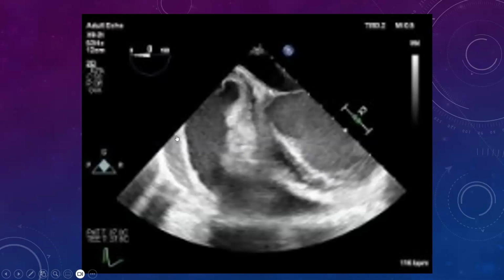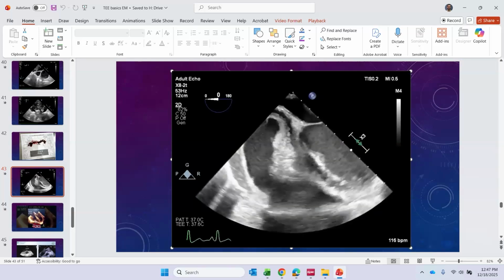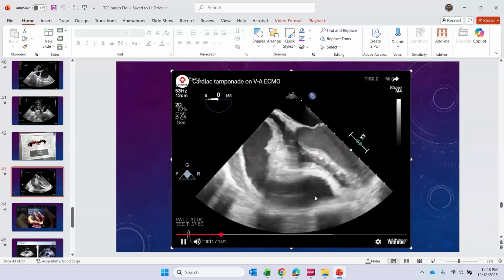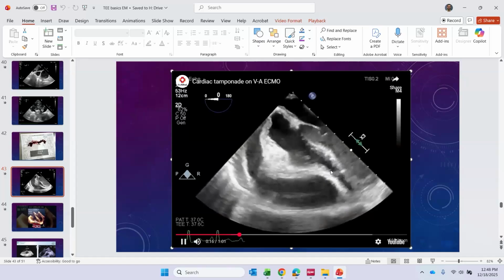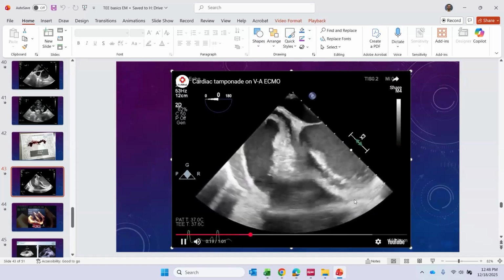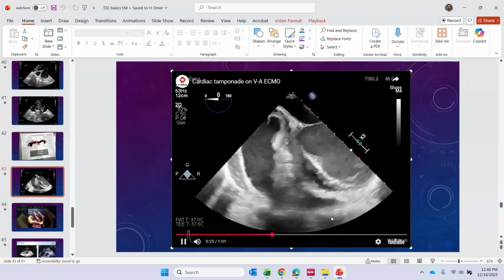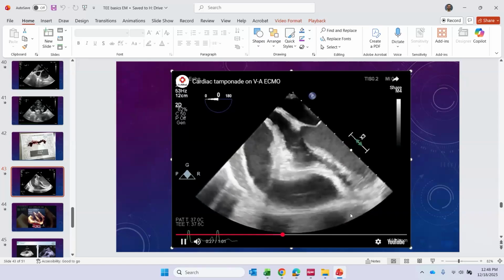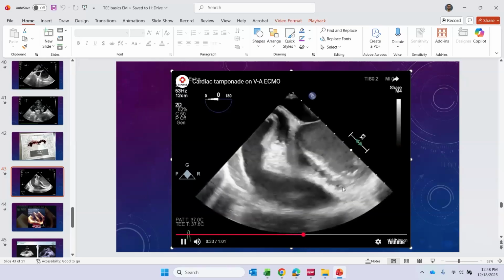Now we have a couple different pathologies. Obviously, we all know tamponade is a clinical diagnosis, as we're told over and over again, but someone want to just give a stab at what the view is here. Dropped our echo probe in, our omniplane angle is at 0. It looks like it should be a 4-chamber view, but there's a lot of extra stuff here, right? Yeah. Our RV is completely collapsed. Our RA is collapsing. We have collapse of our right-sided structures in systole and in diastole, and we can all see why. We have this very large pericardial effusion.